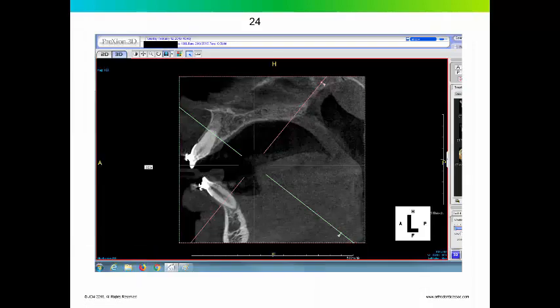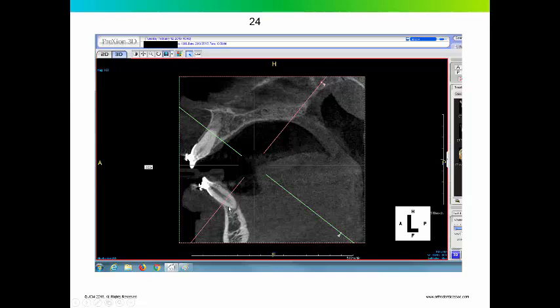Here's tooth number 24. You can see where it is relative to the alveolar housing. This red line here is approximately where you start to pick up alveolar bone as you scan from the clinical crown down to the apex of the root. Obviously, there was no cone beam CT to start with, so I have no idea how much bone was around that tooth to start, but I would guess it was a lot more than what's there now.